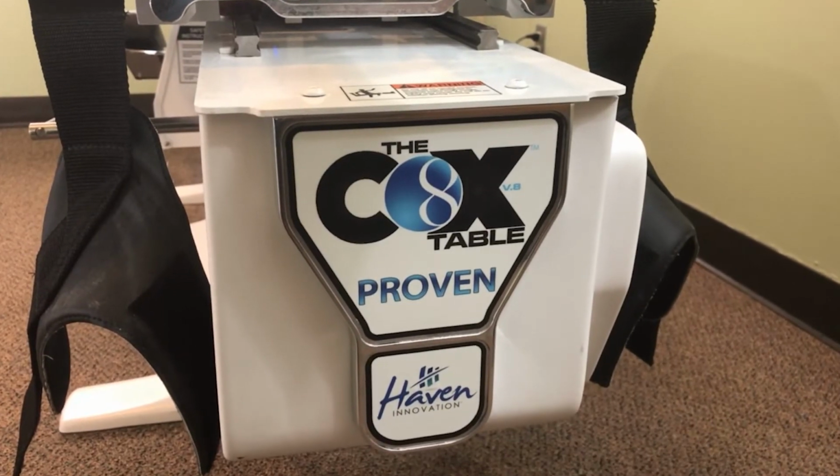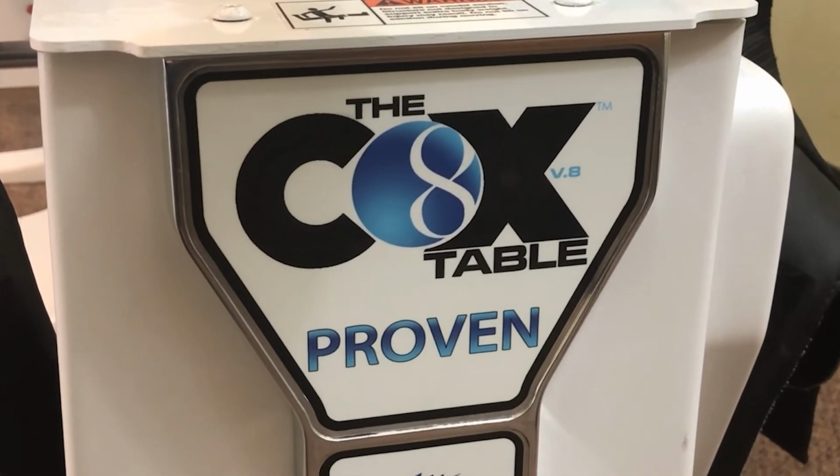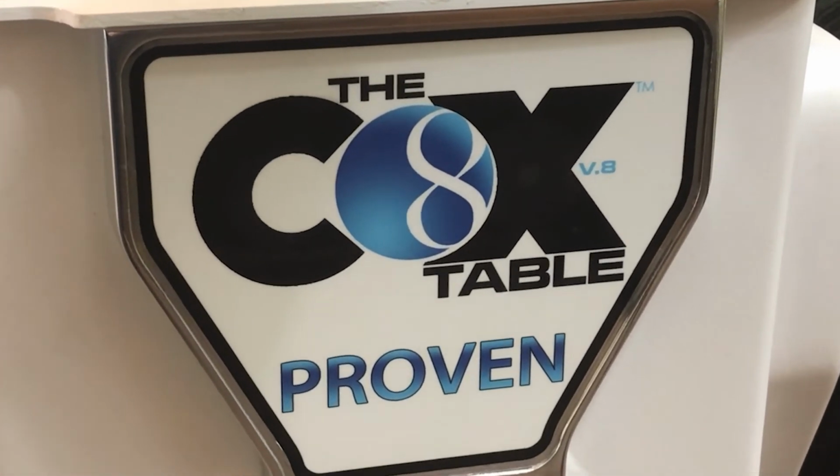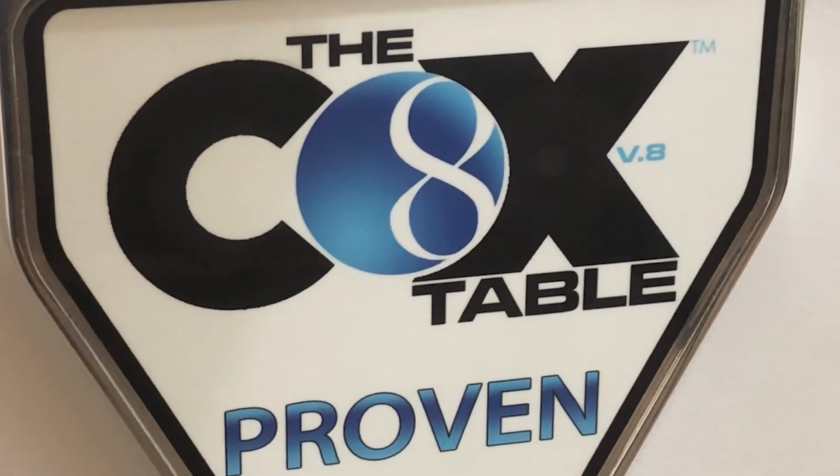Cox-8 force tables are made by Haven Innovation. There are only a few of these around. As of this filming, there are only 2 Cox-8 force tables in Kansas. One of them is the instrument I use in my office, and the other one is the one that I teach with at the Chiropractic College.